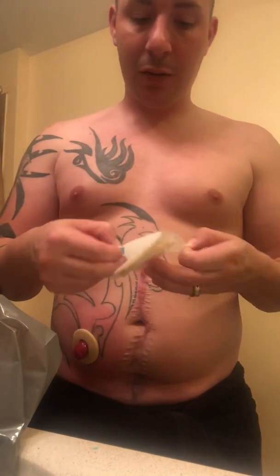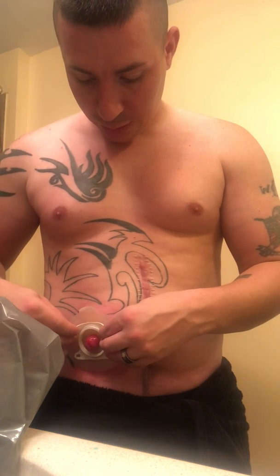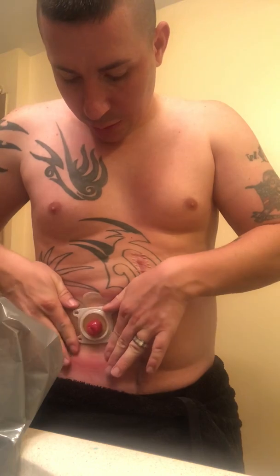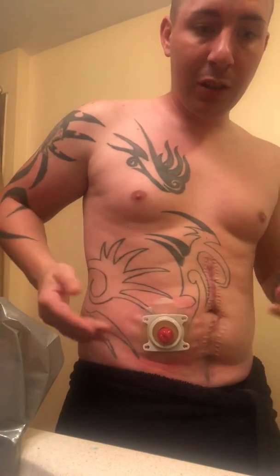If you're out and about, in one of my other videos, your emergency kit video, I talk about bringing the little hand warmers. Or putting it in your underarm. Anywhere where you could put it close to your skin to warm it up. That way, when you are pressing down the edges, you're getting a good, nice, tight seal. So you don't have to worry.